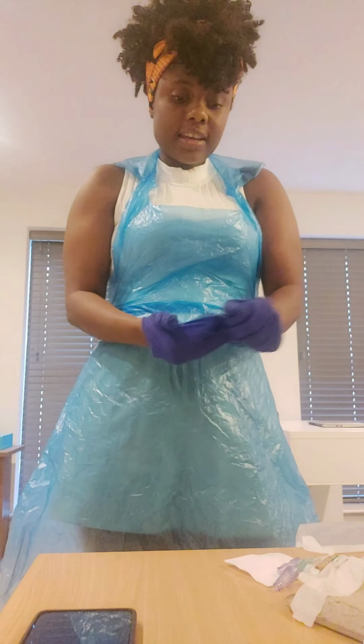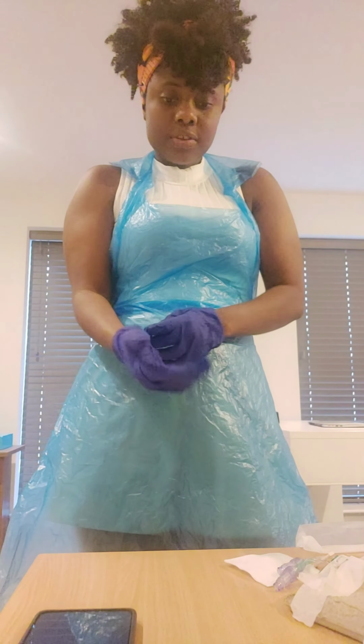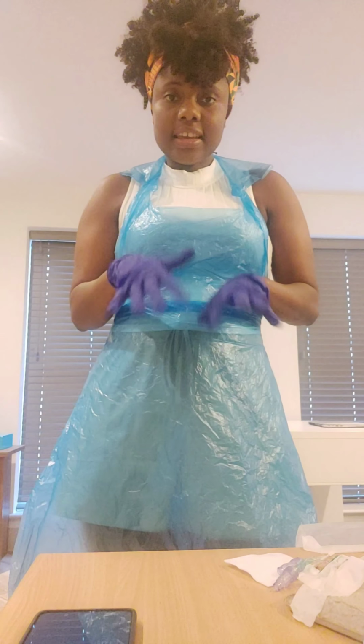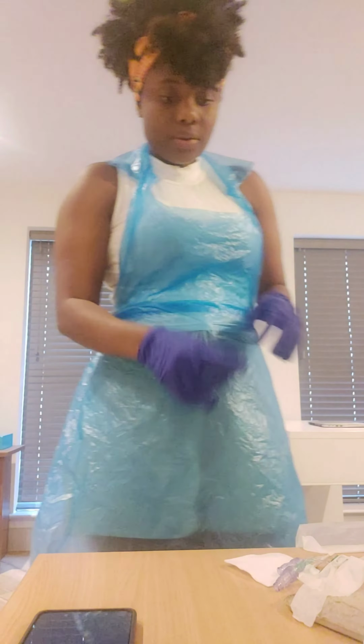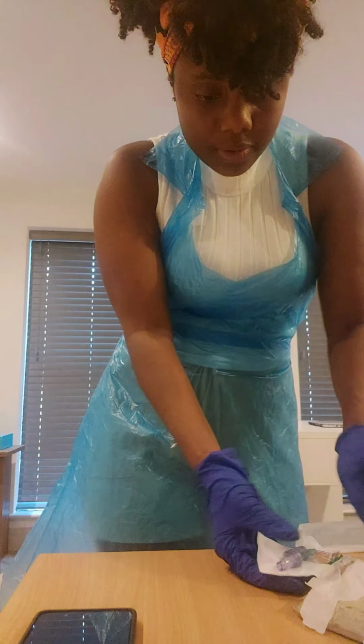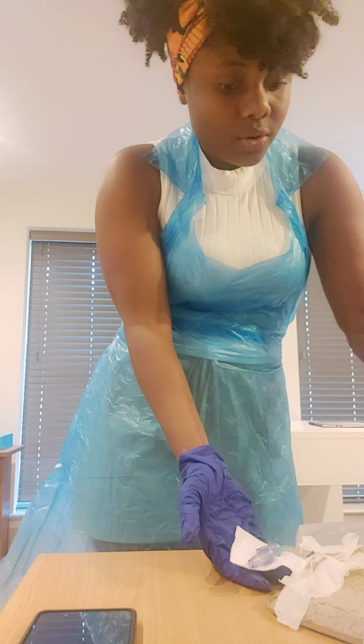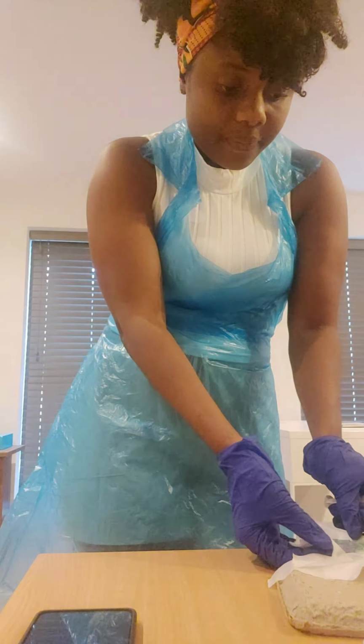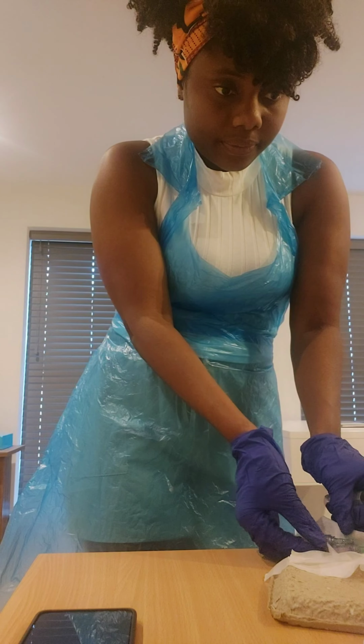I'm going to clean the end of the IV port using aseptic non-touch technique. Make sure that it doesn't touch the end of the bed. Okay, so I use the gauze to attach to the IV port so I don't contaminate it.